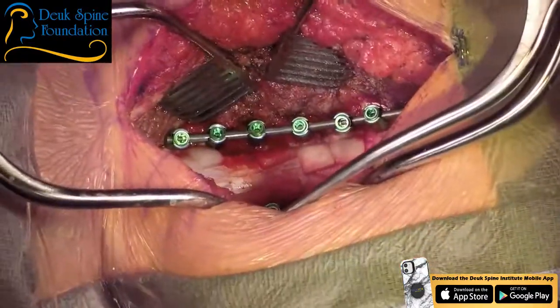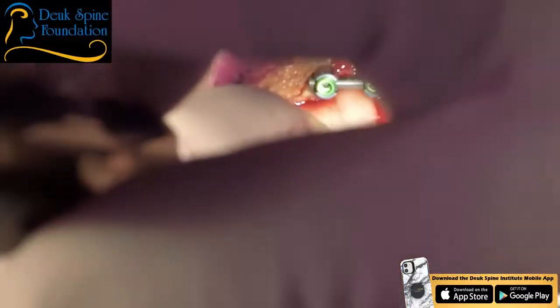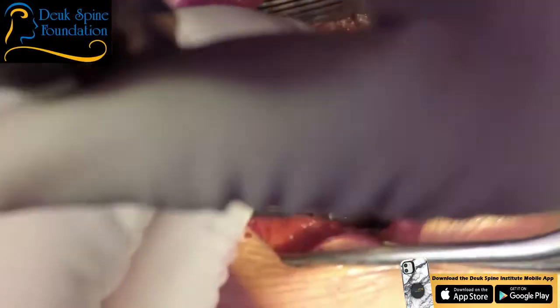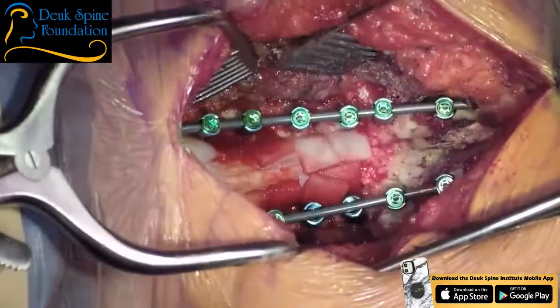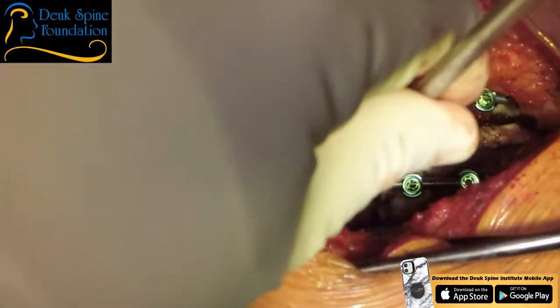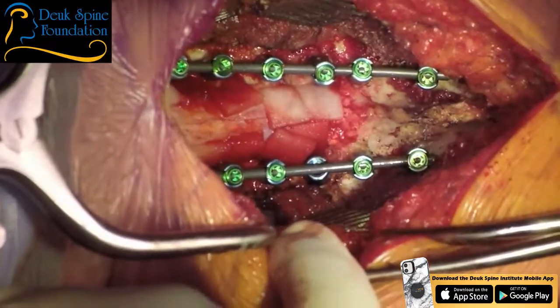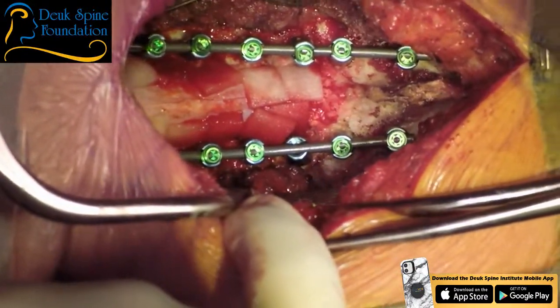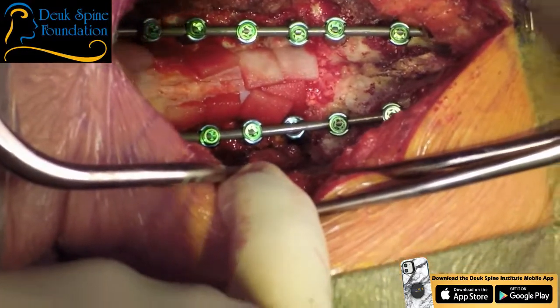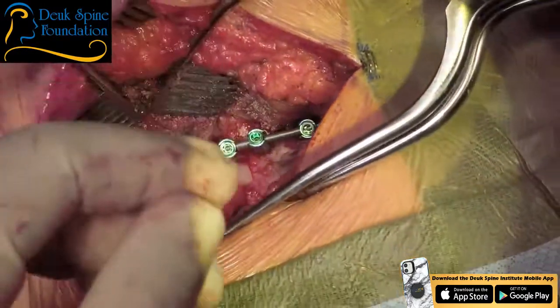Anything cross-threaded you can see? I don't feel cross-threading. I don't see cross-threading, do you see? Everything looks good? It feels good. I may need a persuader here. I may, but I may not. Let's see. I think I will, but first the set screw. Yeah, I need a persuader.